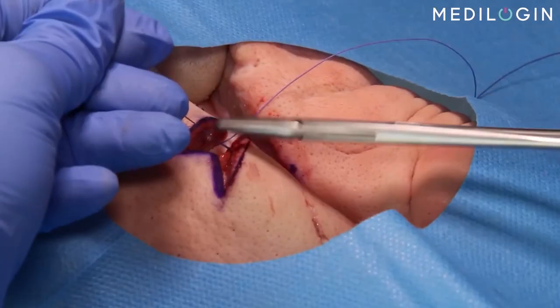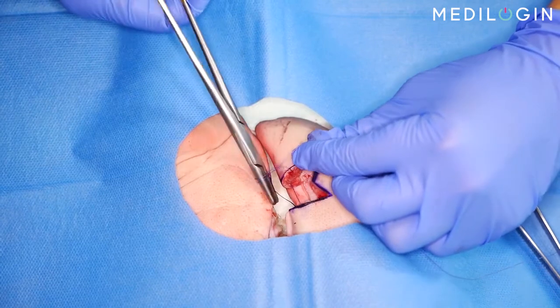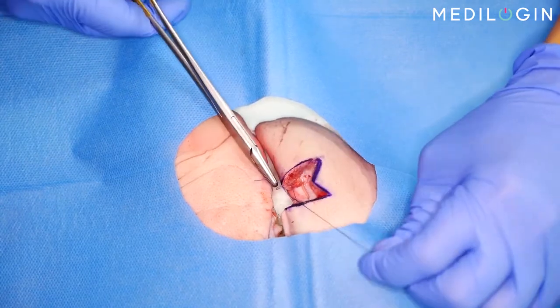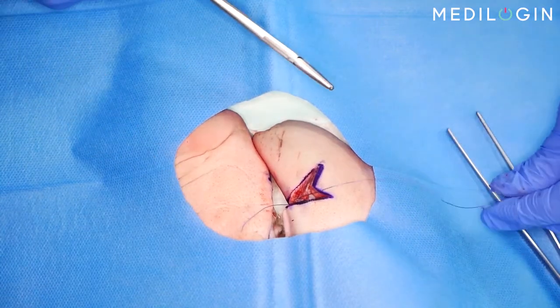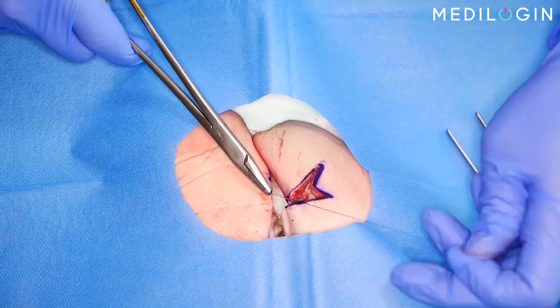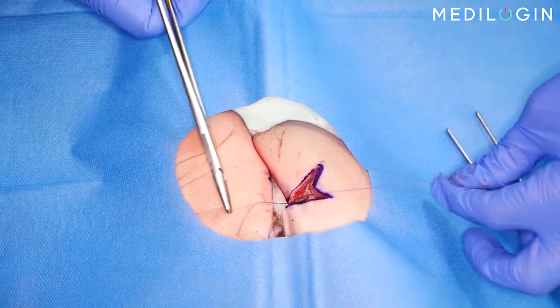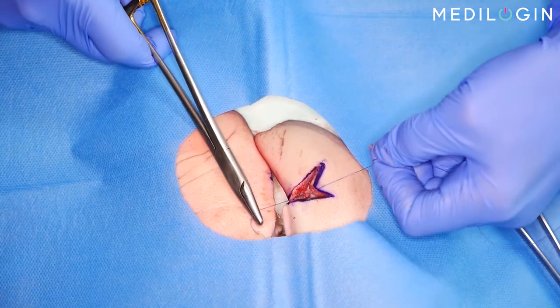Tie the surgical knots, 2 loops in one direction, one loop in the opposite direction, and finally another loop in the initial direction. It is imperative to remember to use absorbable suture material for the subcutaneous sutures. Then pull the suture very tightly.